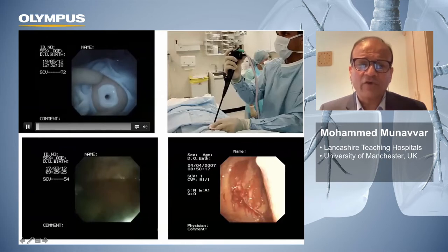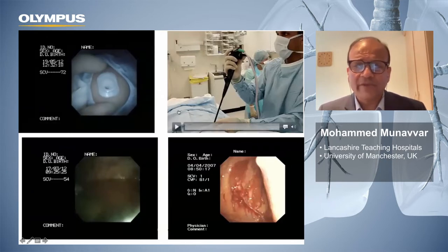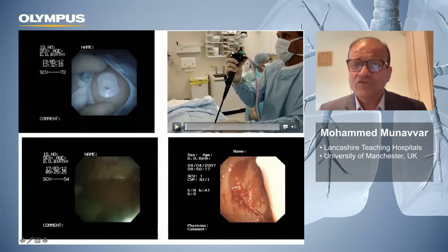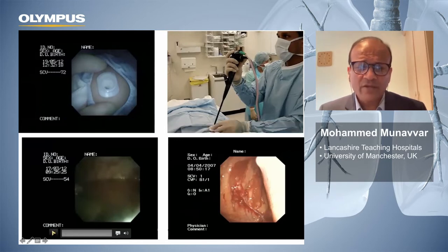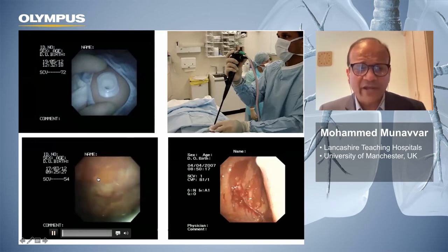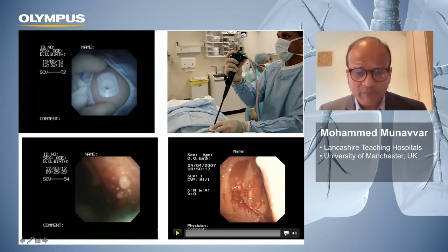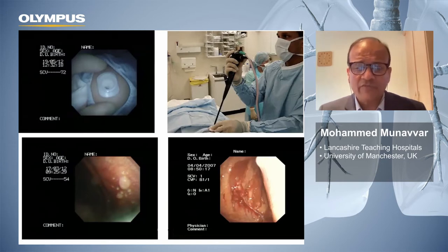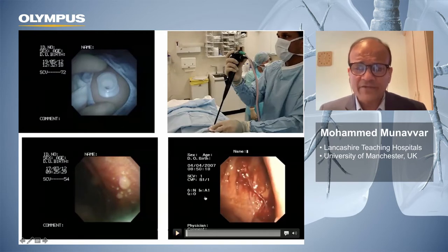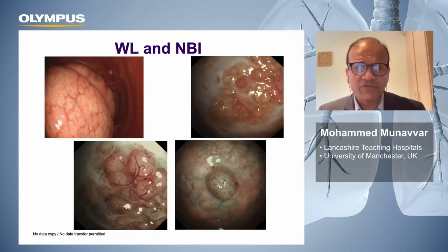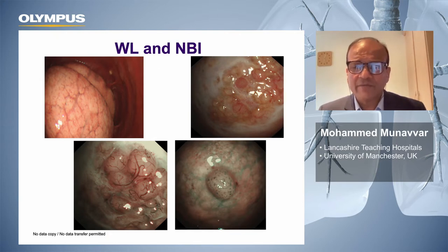Once you have access to the pleural cavity through the cannula, you introduce the thoracoscope — operated just like a bronchoscope — and suction fluid as you go in. You then look into the pleural cavity and can see a variety of changes. In this patient you can see multiple nodules, as seen typically in tuberculous pleural effusion or metastatic disease of the pleura. In some cases you also use narrow band imaging to get better quality images alongside standard white-light thoracoscopy.